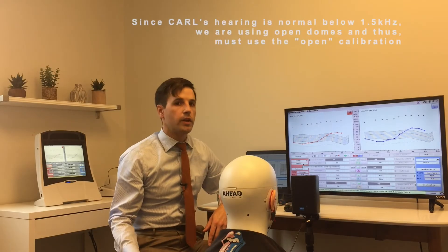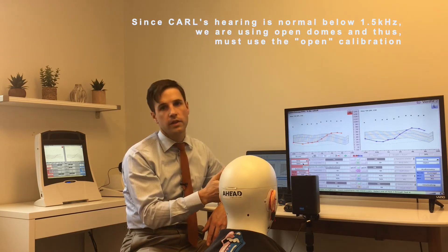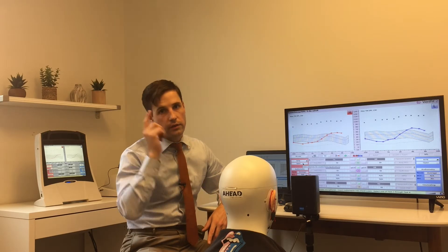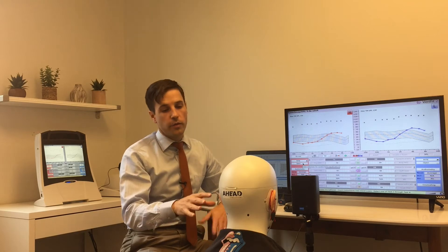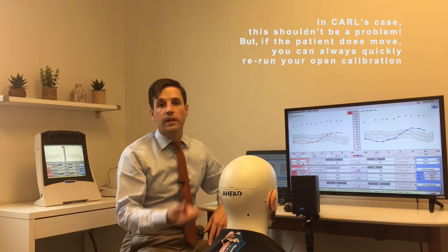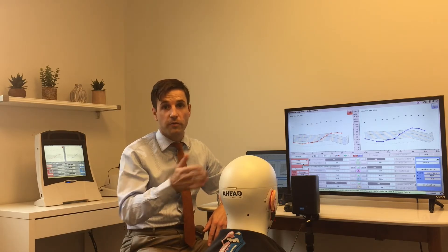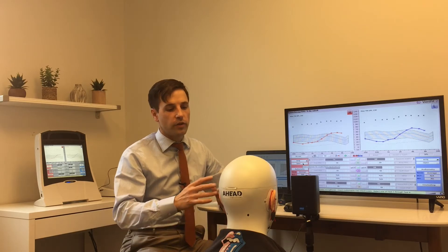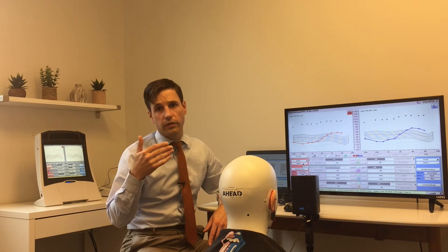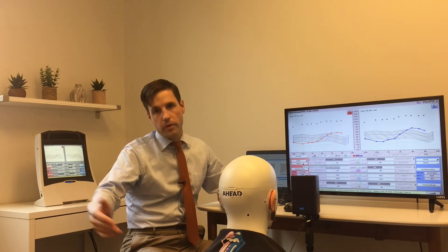A quick note on calibration: if it is set to open, it calibrates once at the very beginning. You have to make sure that when you calibrate, either you don't have the hearing aids in or the hearing aids are muted, and then you have to have your patient stay there and not move for the rest of the measurements. If it's set to occluding, it calibrates before each measurement so the patient can move around a little bit in between. The Verifit is really good because it uses that stored calibration either just before the measurement or at the beginning for all the measurements.